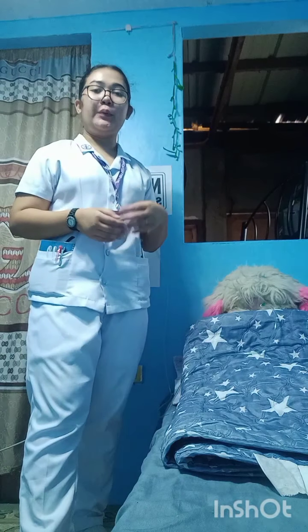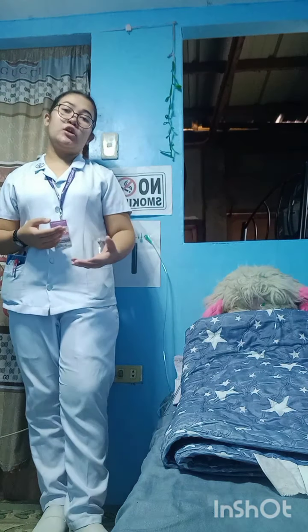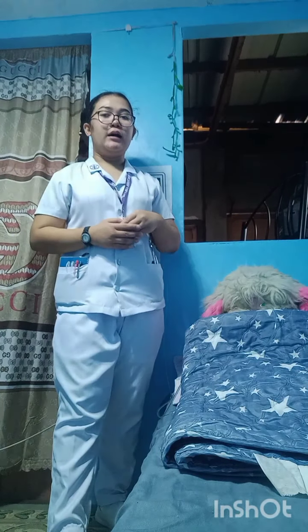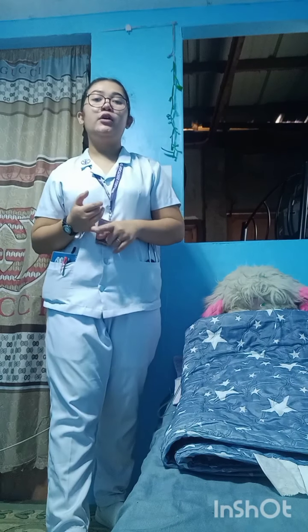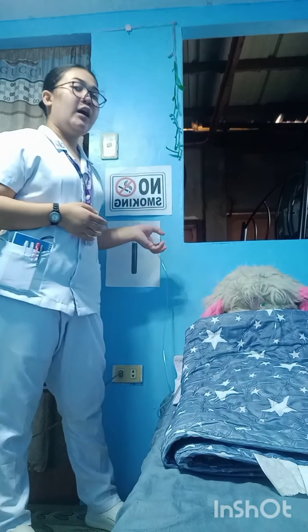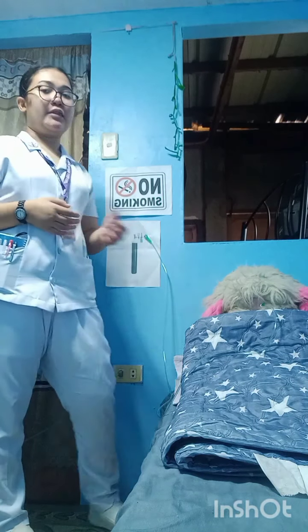After that is we're going to make sure that the safety precautions were followed by asking questions to the client na sinunod ba nila yon or wala ba silang nilabag doon sa mga sinabi ko kanina, for example, bawal manigarilyo sa loob ng establishment na ito, tsaka bawal ang mga pagsindi ng posporo or mga bagay na may apoy, tsaka yung especially dun sa mga paggalaw ng ating wall outlet or di kaya ng ating oxygen tank.